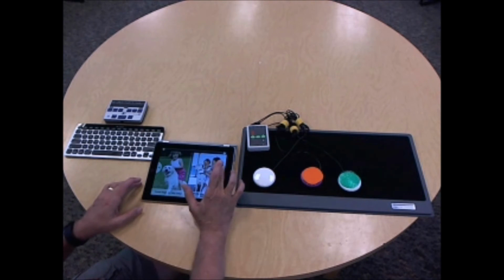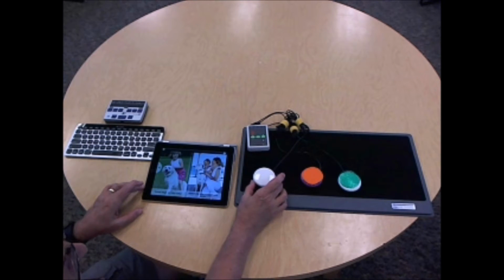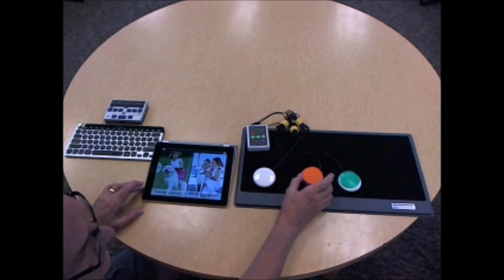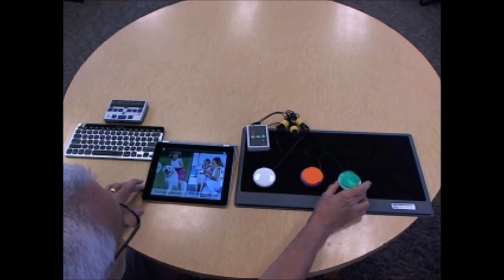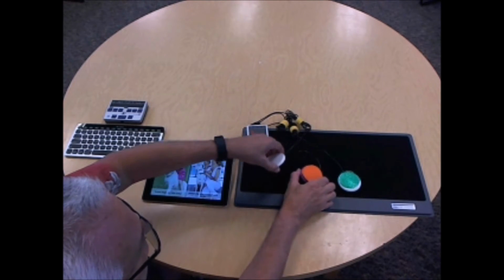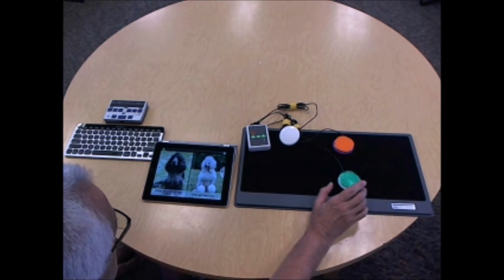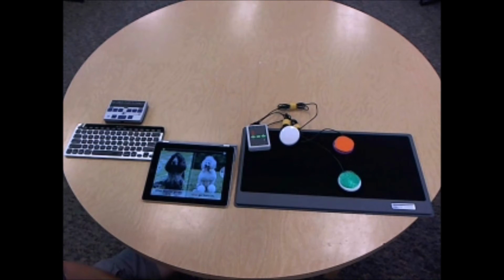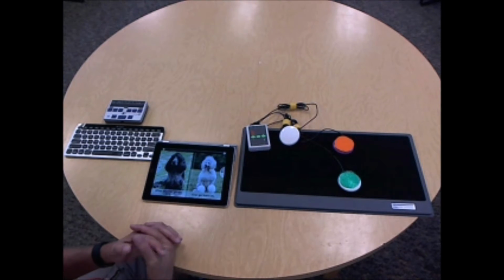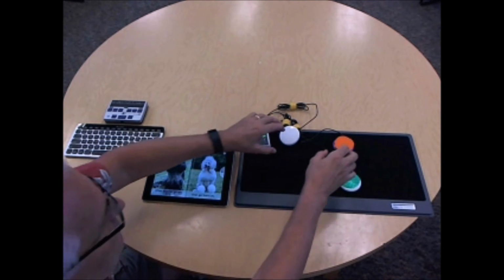First app I'm going to show is just from the Grasshopper books, and I have 3 switches here. It's essentially just a VO left, a VO right, and a VO spacebar. So with this one, I might just want to work with a child who is just doing one switch, and you could take the other 2 away. You can navigate through the book. Right arrow iPad. When their fur grows long, dogs get haircuts. So this is just a basic starting out with a single switch. You may start out with cause and effect, but I would recommend don't stay too long on cause and effect.